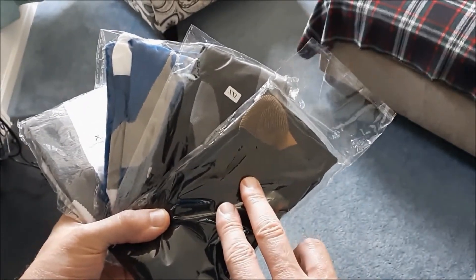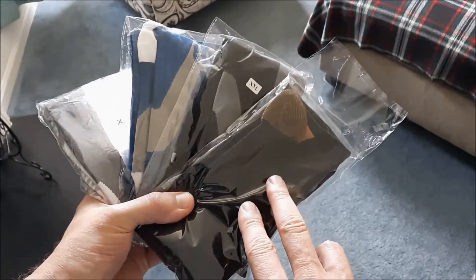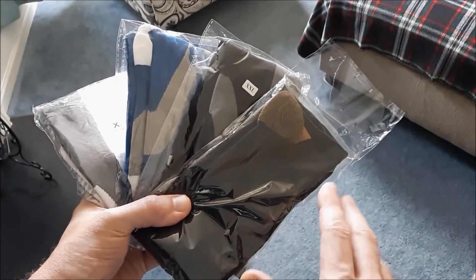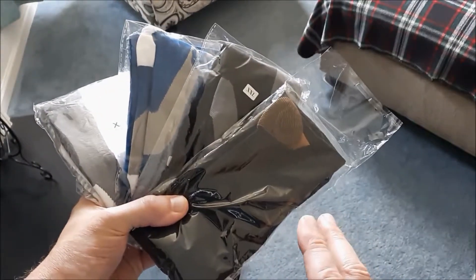I'm probably not going to put these on. I may take them out and just show you, but it's hard for me to put these on in general, so I'm going to try to take them out of the package and give you a basic review on them. But that's what they look like — I thought I'd give these a try.